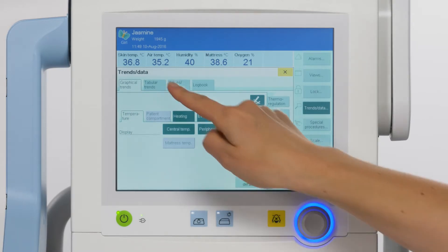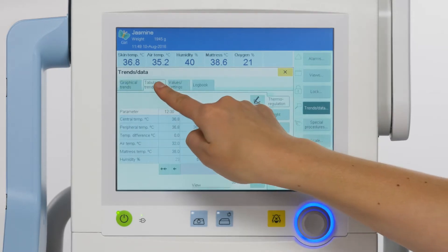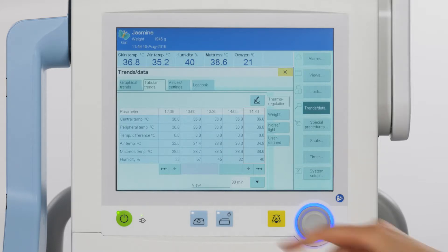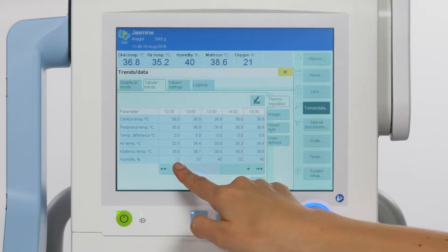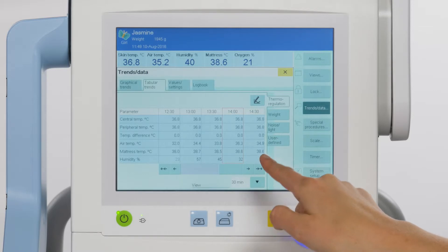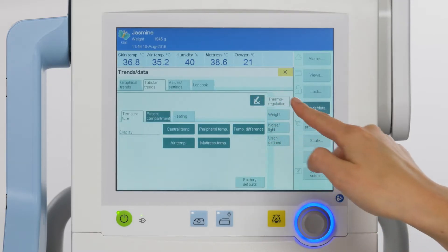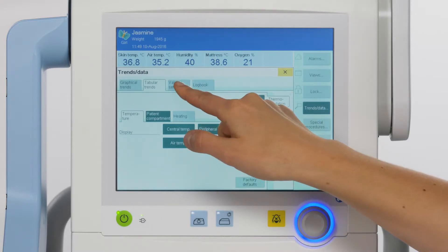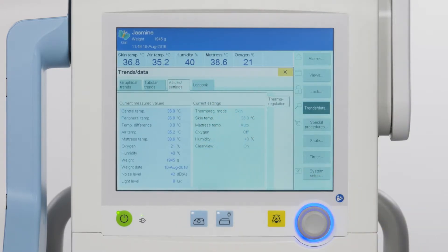The second tab is tabular trends. Trends are displayed in tabular form in the tabular trends tab. The temporal resolution of the display can be set from 30 minutes to 24 hours. Earlier time periods and other parameters can be displayed with the arrow keys. Use the pen icon to change the overview. The third tab, values and settings, displays all the current values and settings for thermoregulation.